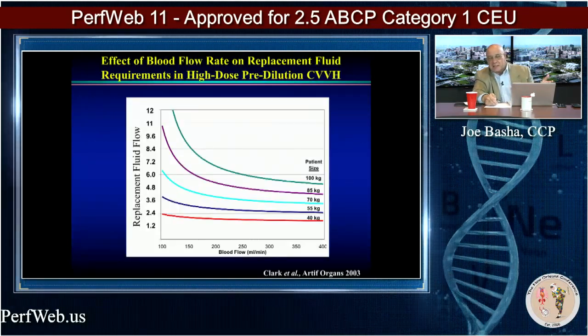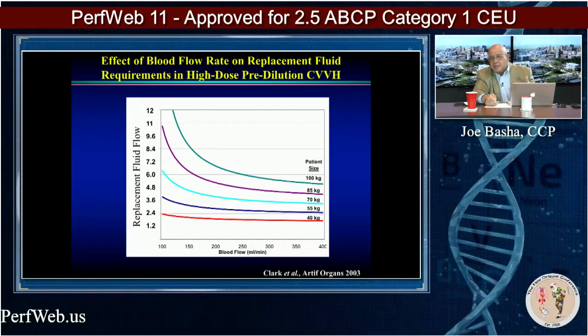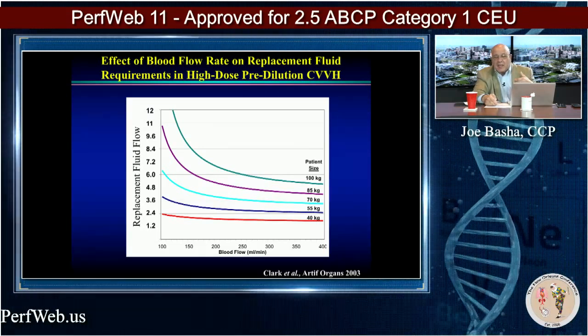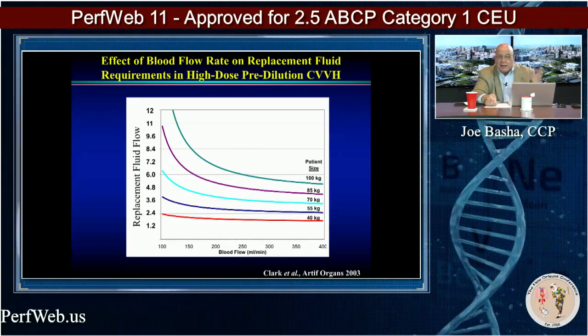Of course, all of this is solved if you just hook it into the ECMO circuit, but if you are involved in the ICU and you are using this on patients or you're consulting or whatever it may be, providing the service. We actually provide a CRRT service. I think we do it better than anybody else does.